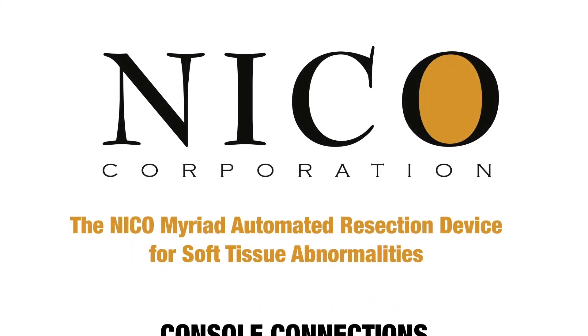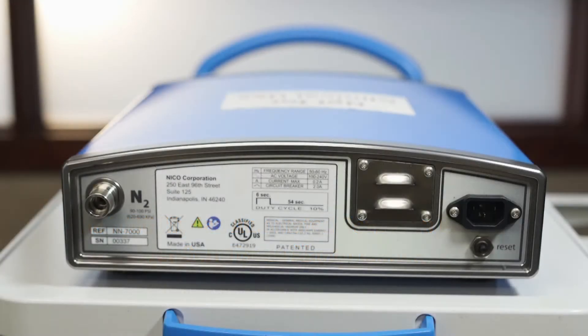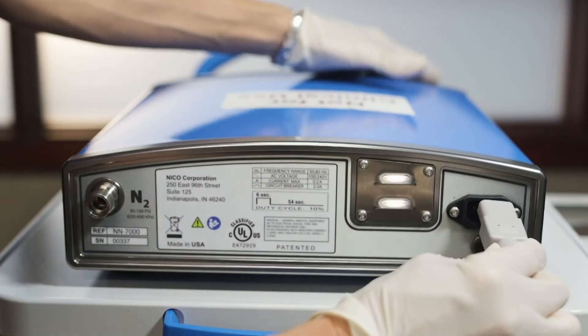The NICO Myriad automated resection device for soft tissue abnormalities. The power cord connects the console to a power supply outlet.